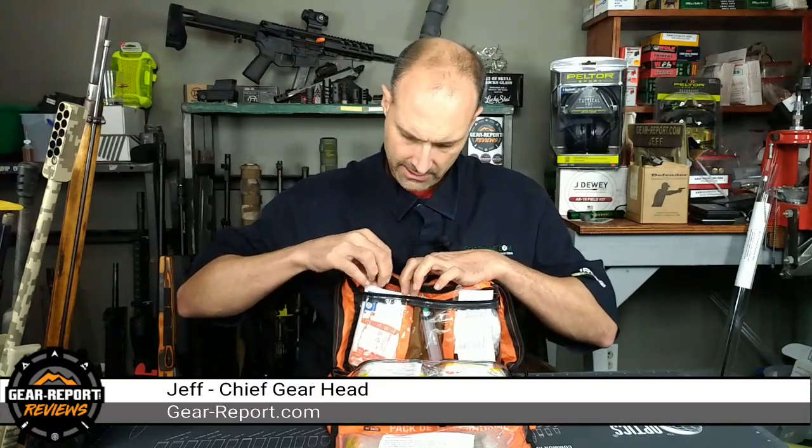All right, this syringe is in there as well. Let's see, Irrigation Syringe. It's a 20 cc with an 18 gauge tip. That's a plastic tip, so not for injecting other stuff, but for irrigation.